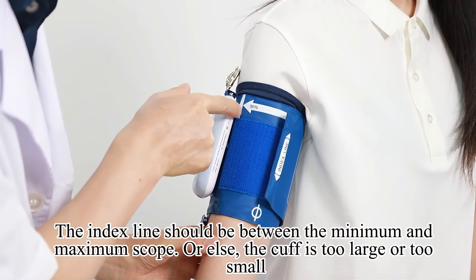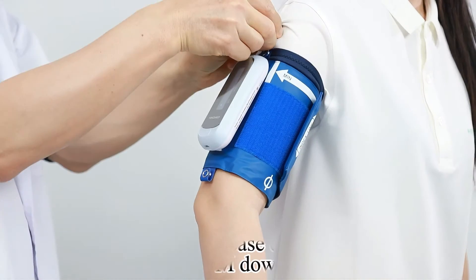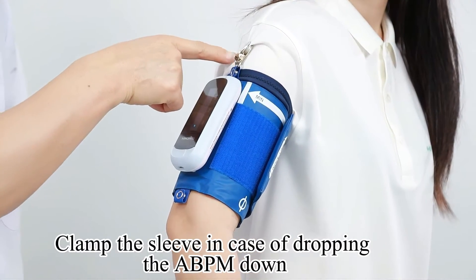If the index line is outside the range, the cuff is too large or too small. Pressure beneath the cuff of about two fingers is preferred. Clamp the sleeve to prevent the ABPM from dropping down.